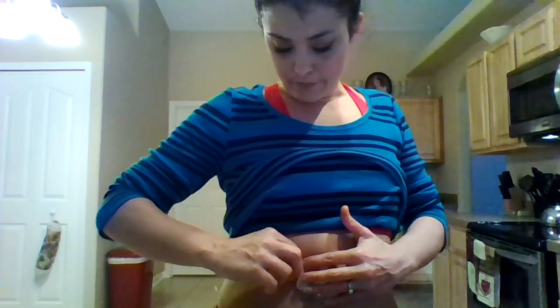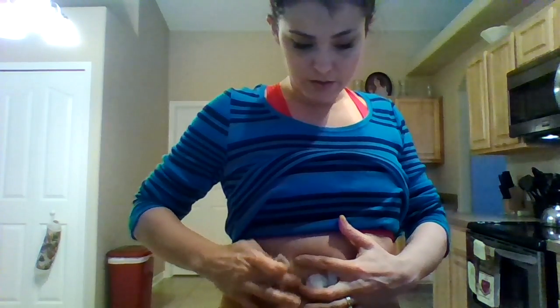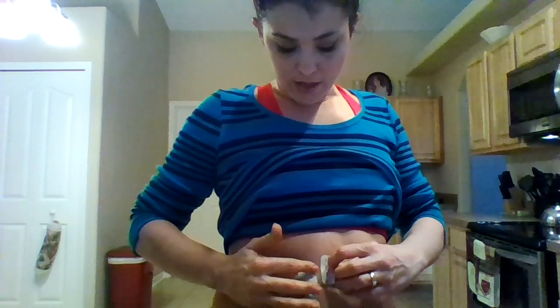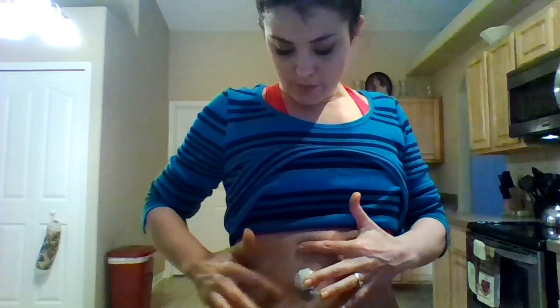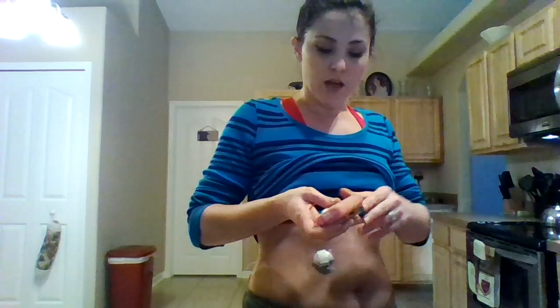So then you just take the little end tabs off here, and rub her down a little bit. Again, it's that friction that keeps the sticky tape sticking there long enough. So now everything is in place and it's set for 6 days. I stuck this back here for now. Normally I stick it to my bra or something.